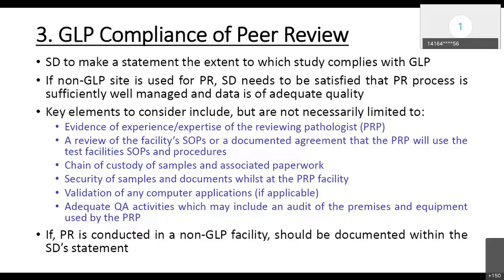So if a peer review pathologist is going to use that, the study director should ensure that it is properly validated before use, and also adequate quality assurance activities, which may include an audit of premises and equipment used by the peer review pathologist. So if the peer review pathologist is using his own instruments, then there have to be some quality assurance activities performed there by the quality assurance department.